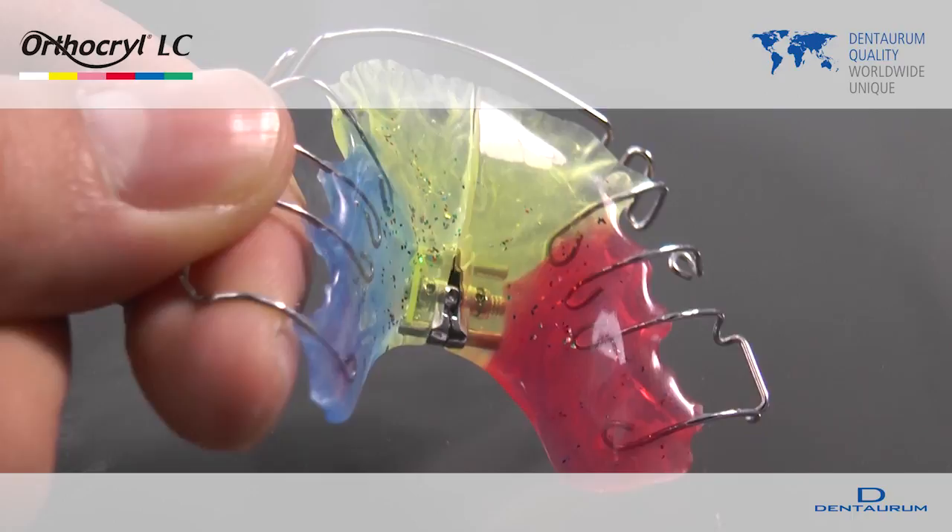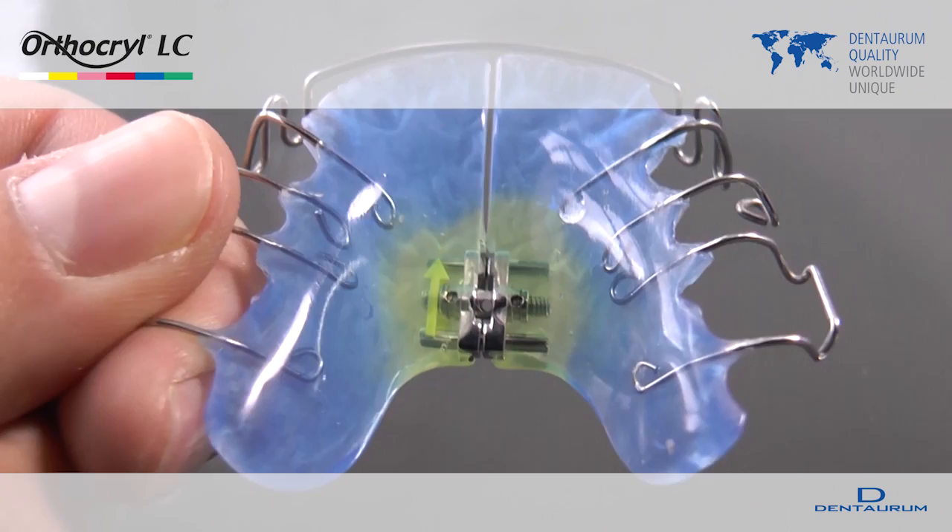OrthoKryl LC is suitable for the manufacture of removable and fixed orthodontic appliances. It can also be used for the fabrication of anti-snoring devices and drilling templates for implants. OrthoKryl LC does not contain methyl methacrylate or dibenzoyl peroxide.